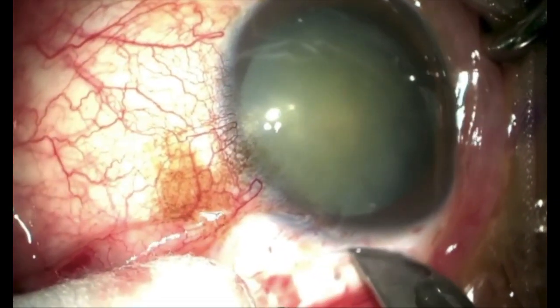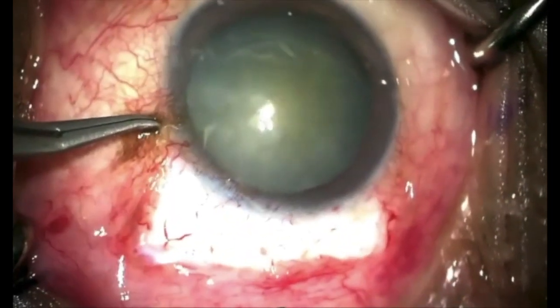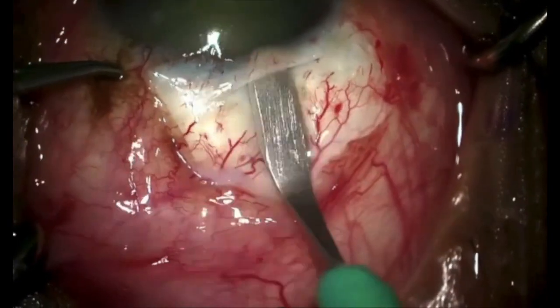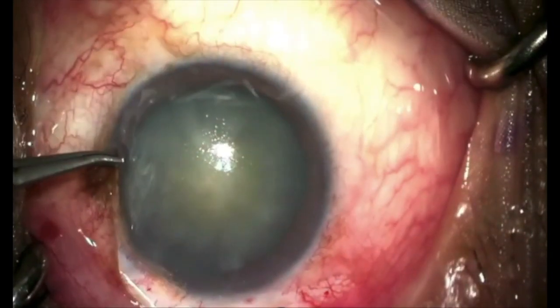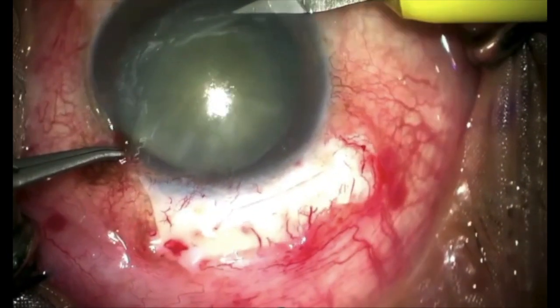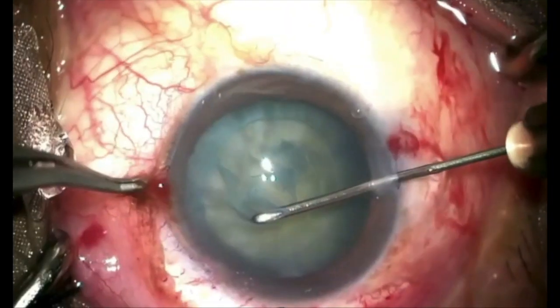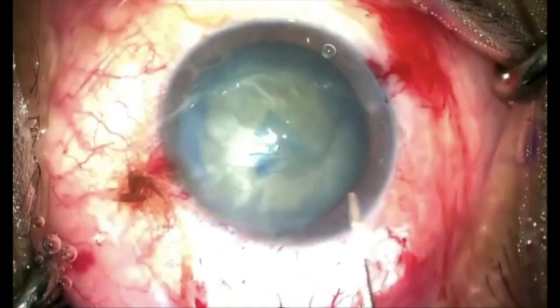After a routine temporal or superotemporal incision using a crescent and minimum cautery, a sclerocorneal tunnel of 6 mm is made with good side pockets. Side cuts are given if the nucleus is of large size. A large capsulorhexis of 5.75 to 6 mm is made using the cystitome after staining the anterior capsule, which is followed by proper hydrodissection and delineation till the nucleus is freely mobile.